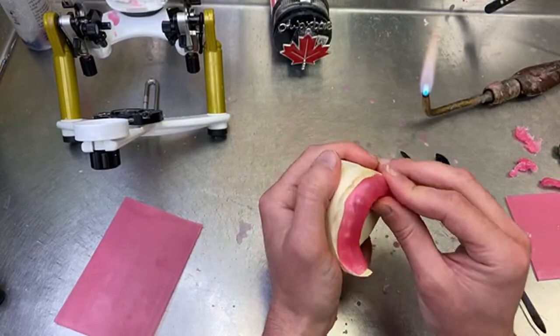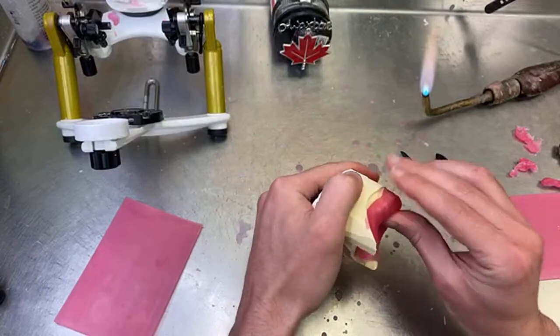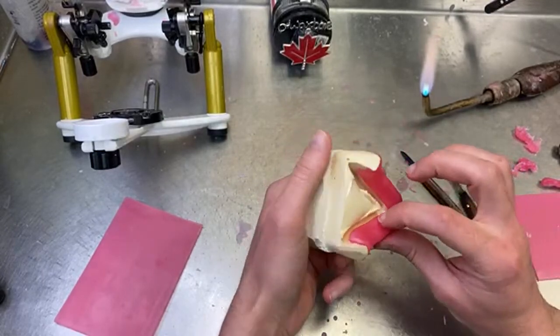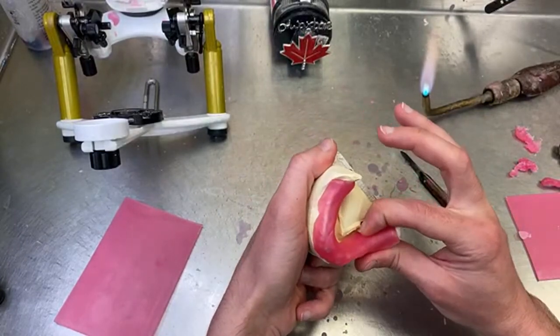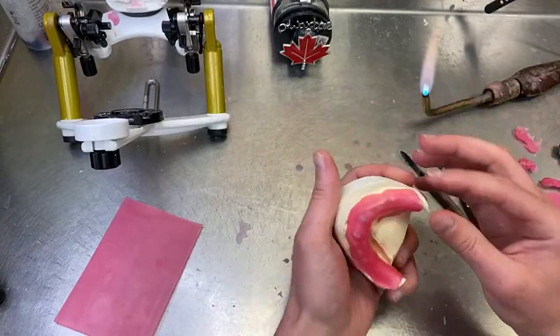So you heat it up to just the right temperature that you can play it like that and manipulate the wax without cutting it or delaminating it. It's like putty now. That's when you get the right temperature on. If it's too hot, you press and it will just tear.